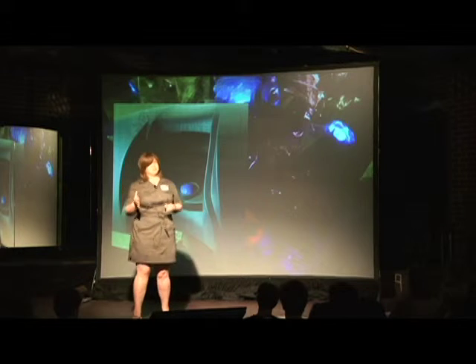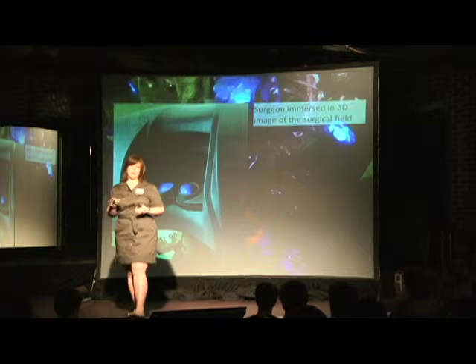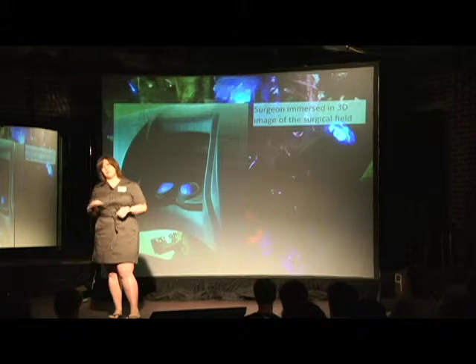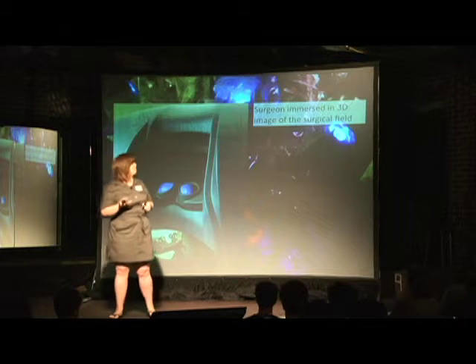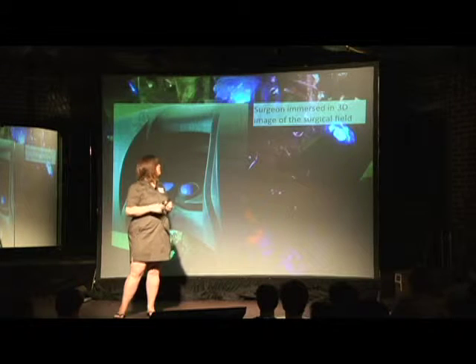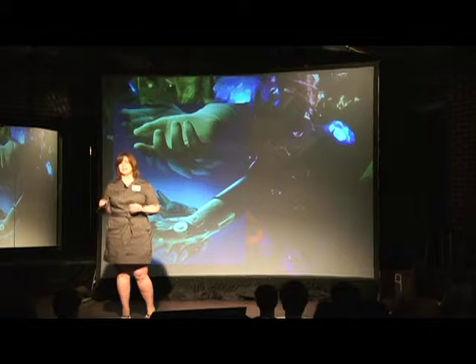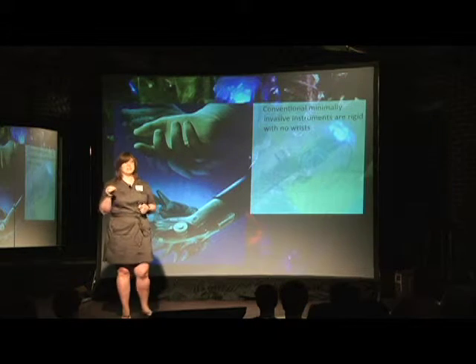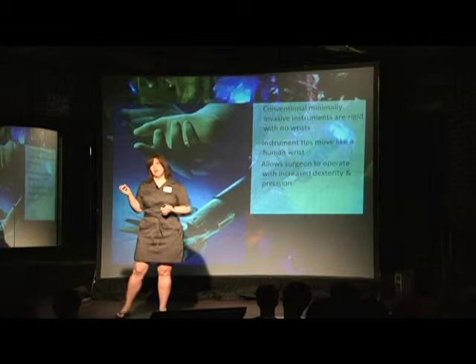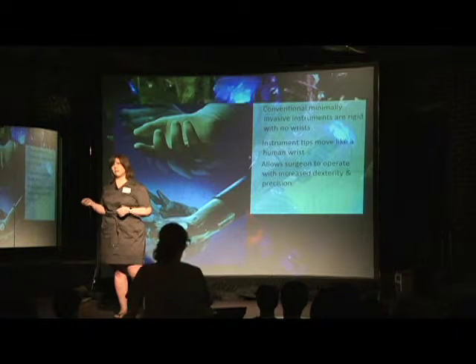The great thing about this is it really helps if the surgeons have been trained and grew up on video games, because they look inside the console in 3D. It's stereoscopic at 12 times the magnification. So it's like they kind of crawled into the body cavity at 12 times the magnification. The arm that you saw is what really allows us to do things that are miraculous. It greatly reduces the size of our instrumentation that we put into the body and allows a greater degree of control and articulation of these hand movements, even greater than the human hand.